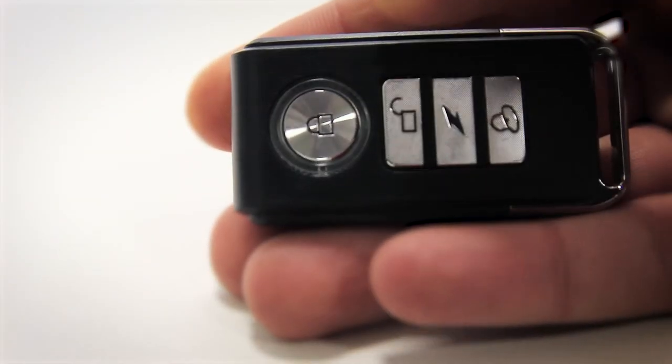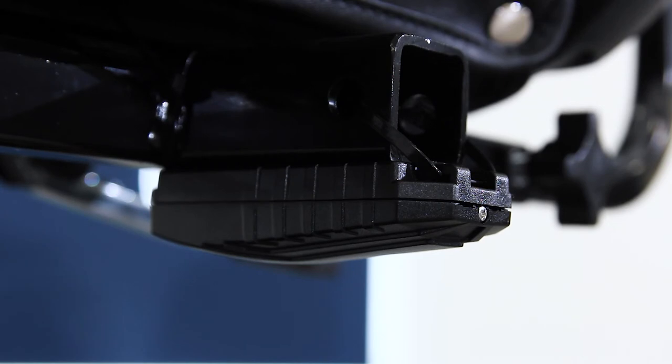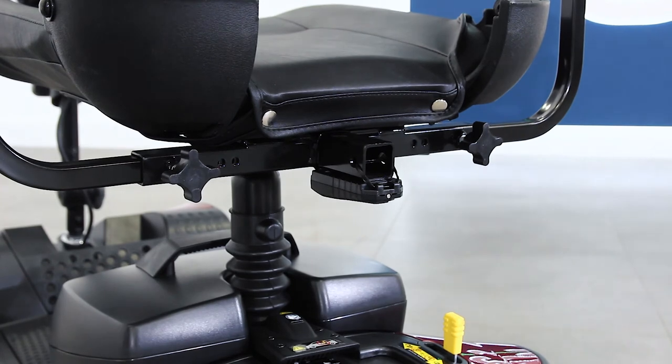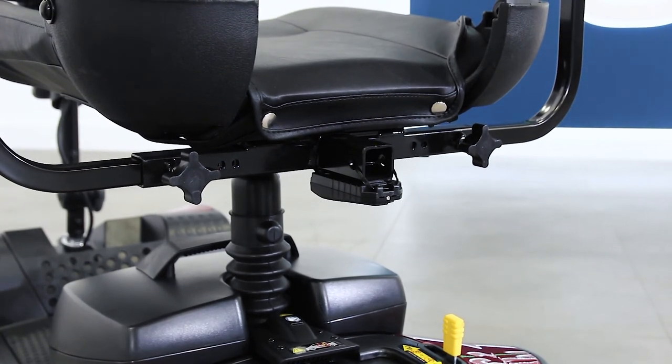Press the button at the top of the remote to activate the alarm. If anybody tries to move your scooter, the alarm will activate, working both as an alert to you and as a strong deterrent to potential thieves.